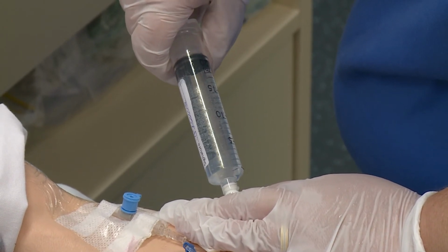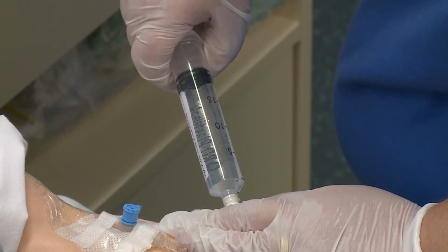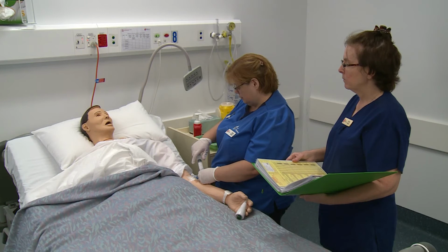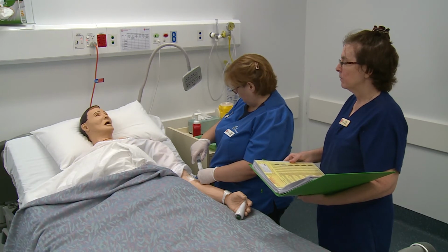I'm going to give it over 4 minutes. All right, so just let me know how you feel if you feel any different from how you're feeling now. I'm just going to keep an eye on my time.